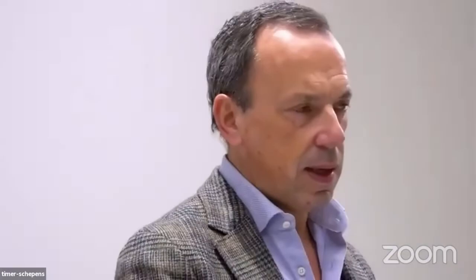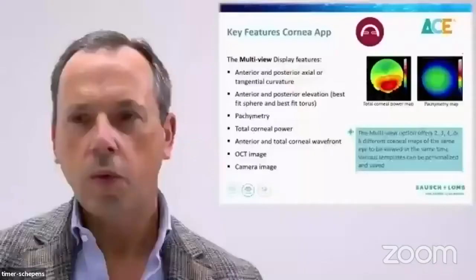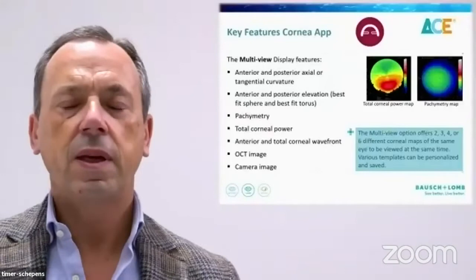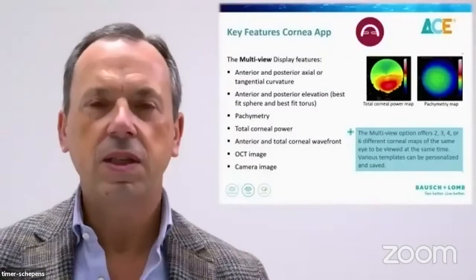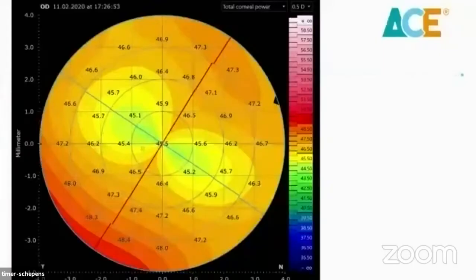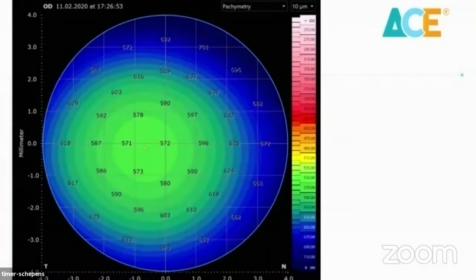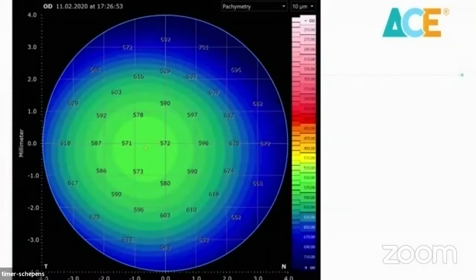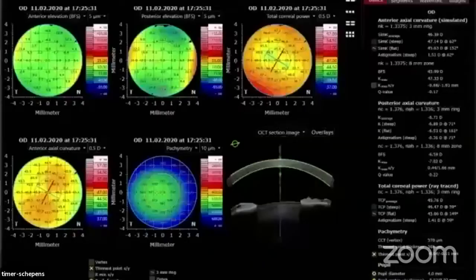The multi-view displays all the data that we need in the cornea. We have the anterior and posterior curvature, we have the anterior and posterior elevation, we have the pachymetry, total corneal power, wavefront analysis, and also the most beautiful density images. Here we have some displays of a LASIK case with all the corneal power of the anterior surface. Here we have the total corneal power of all the cornea, and we have the pachymetry view, the wavefront analysis, and the capacity of having a multi-view map that in the strategy of preparing the surgery is the most important thing.